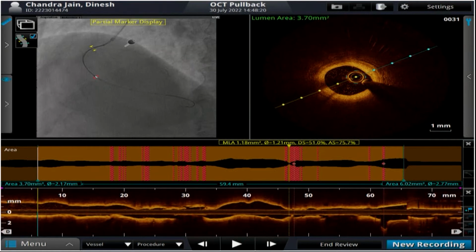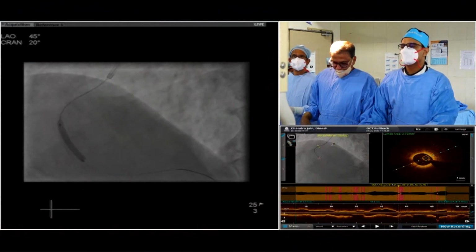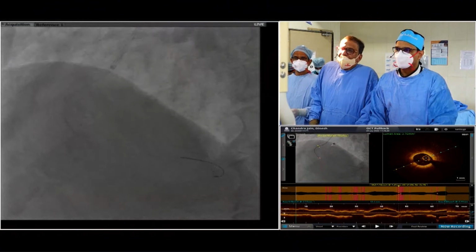Okay. Chinna, I want to see the previous stent inflation cine on the screen, on top, the landmark. Yeah. So what you use here is stent boost to have... Yes. We'll use stent boost. Yes, yeah. Yes, we will. Absolutely.